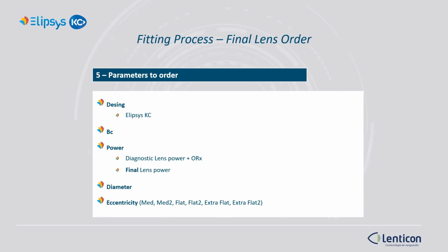These are the parameters that are needed to place the order: the design, Elipsys KC, base curve, power, whether it's the diagnostic lens power and over-refraction, or final power, diameter, and eccentricity level.